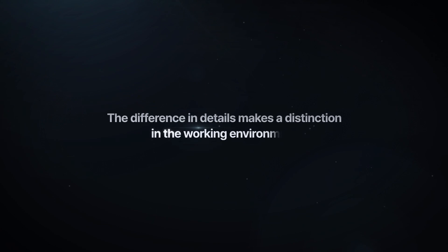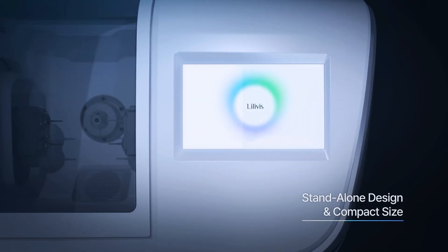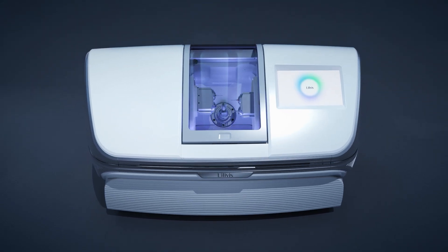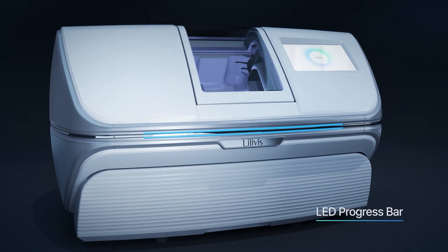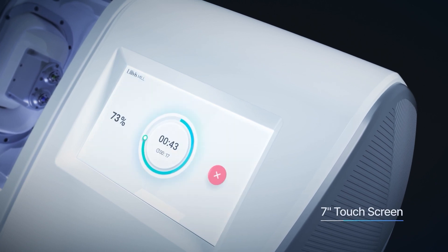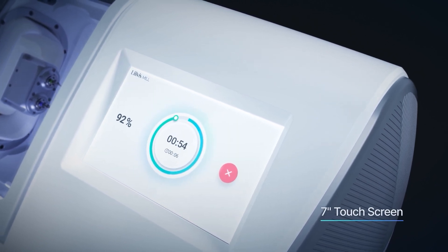The difference in details makes a distinction in the working environment. Connect the power and network to start immediately. The LED progress bar allows you to easily check the processing status from a distance. The 7-inch touchscreen provides intuitive access to various operating information, maximizing user convenience.